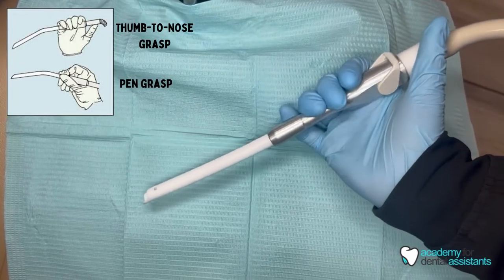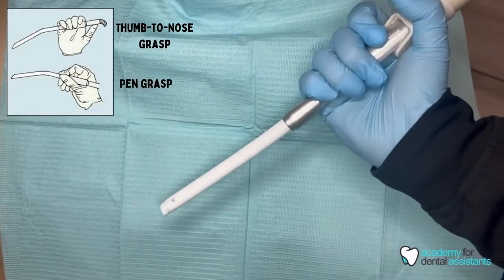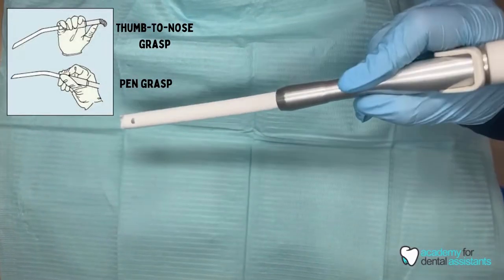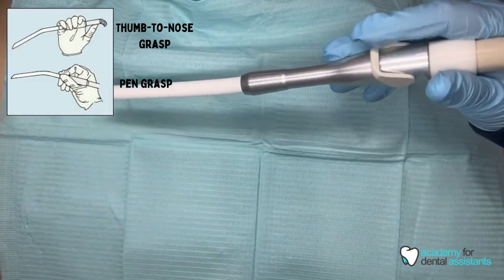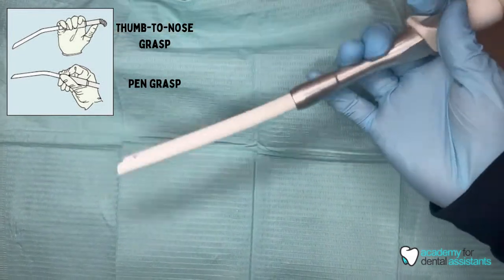There are two main ways to hold the HVE. The first way is the thumb-to-nose grasp, and the second way is the pen grasp. Whichever way you decide to hold your HVE, it's personal preference — whichever is more comfortable for you.